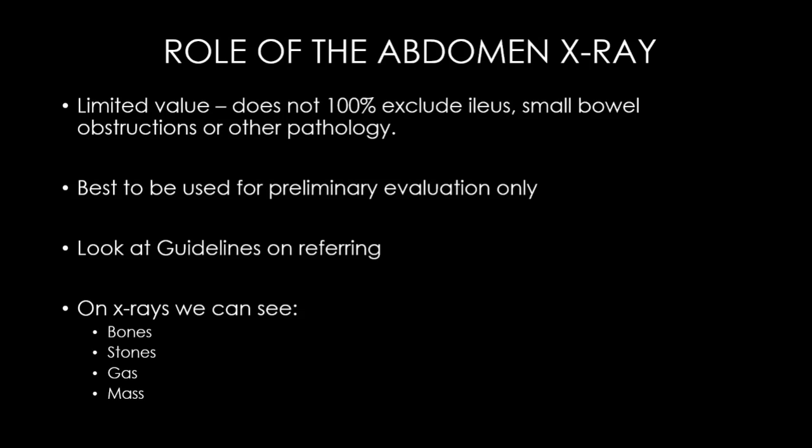In acute abdomen, with suspected large bowel obstruction, CT is the investigation of choice because, again, it confirms diagnosis, level, and cause, which x-rays can't do. But it may occasionally be helpful to do x-ray in limited cases of large bowel dilatation, like volvulus or colitis with suspected megacolon. Again, volvulus is something we'll talk about in another video.